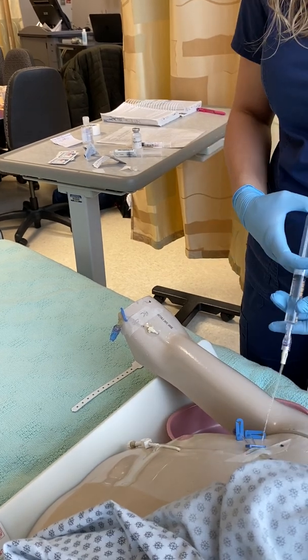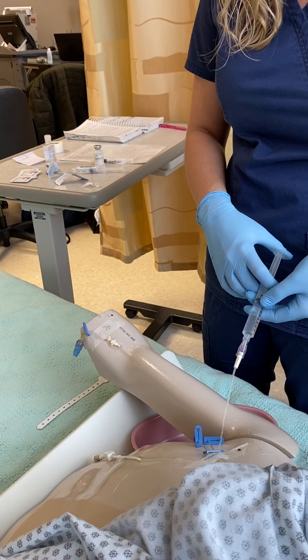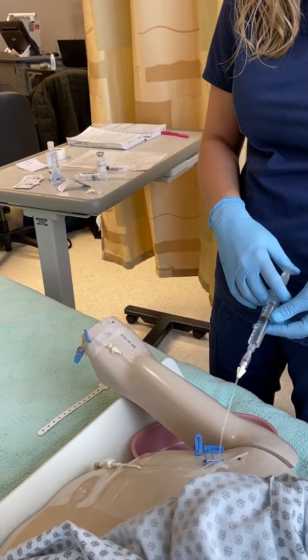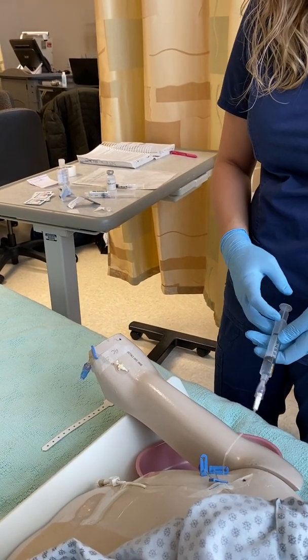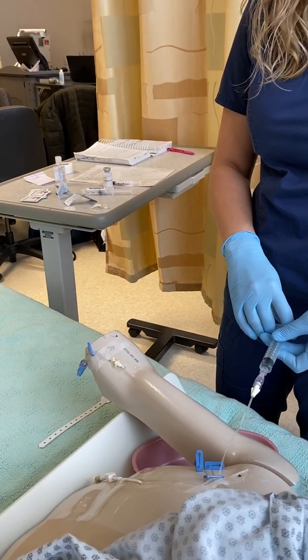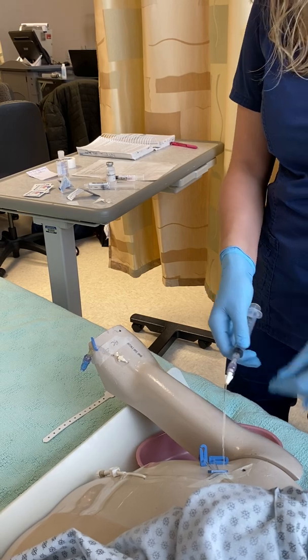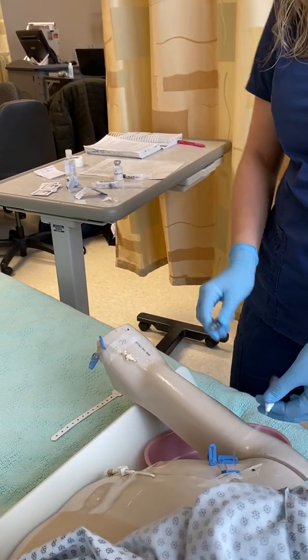And then your pre-flush, you're just looking for patency, making sure that you don't have any resistance and that the flush runs through just fine. And you flush for however much your facility calls for. In this case, our facility says we flush with 10 mLs before. So go ahead and clamp that again, and I'm going to remove this.